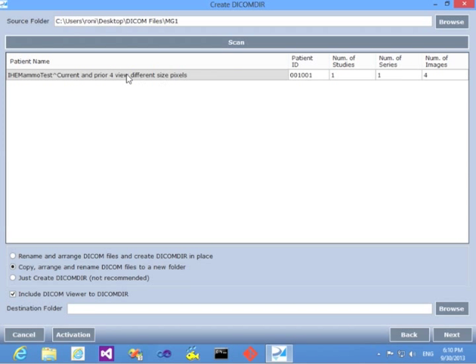I can see the patient name, I see the patient ID and there's one study on it, one series and four images.